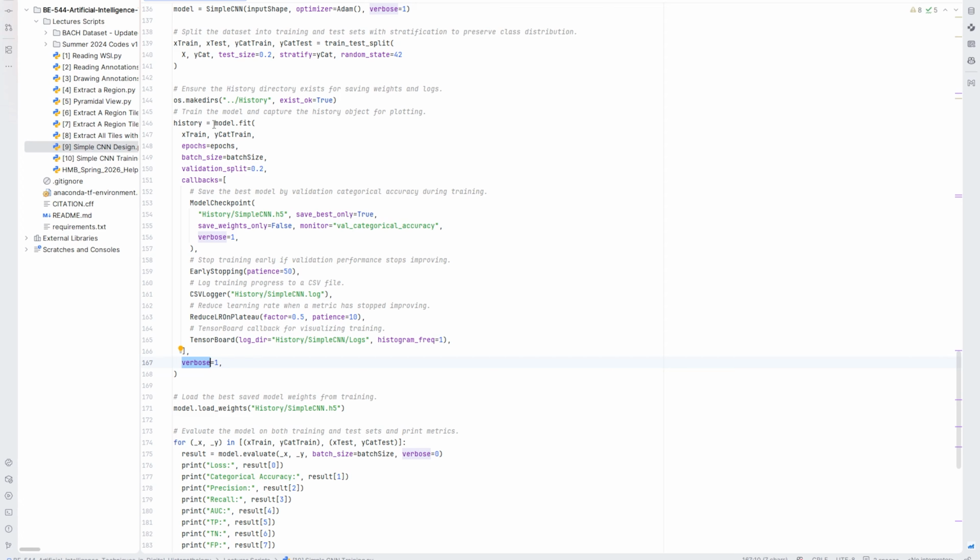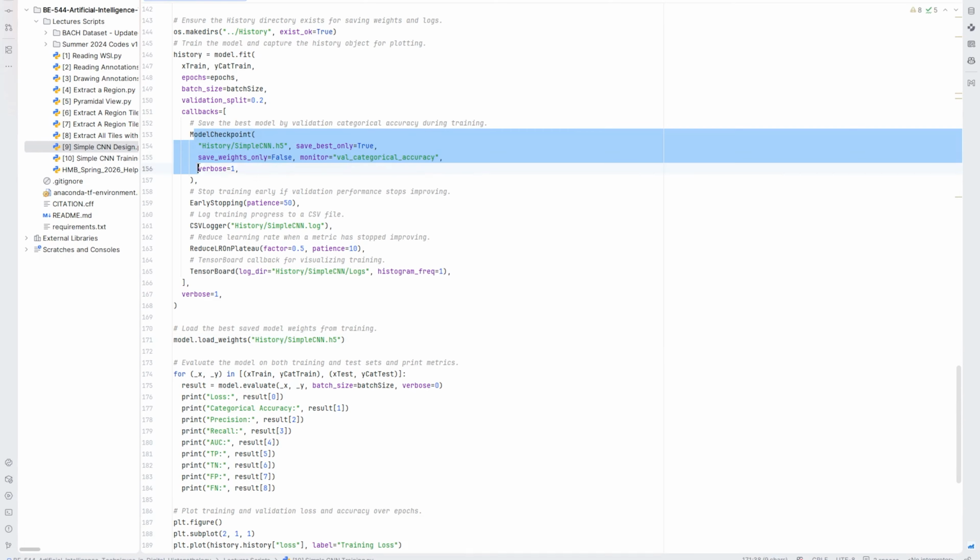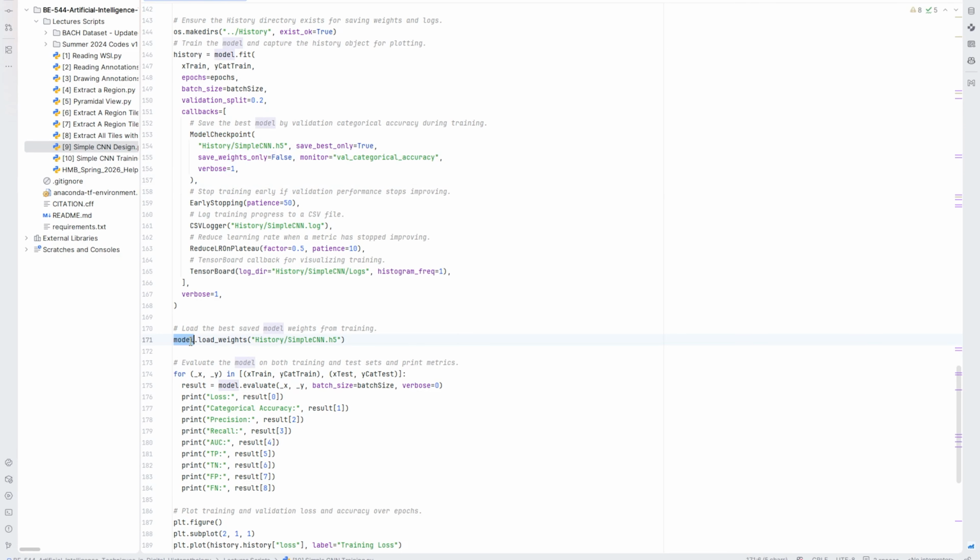Now, after the completion of the training process, the model is ready, and you can access the best model from the checkpoint. Also, the fit function returns the history, and the history contains the history of the training and validation over the number of epochs. At this point, we have a tuned model. So you can load it using load weights, and those weights are the best as they are stored by the model checkpoint. Now you can use the tuned model to make any further predictions.